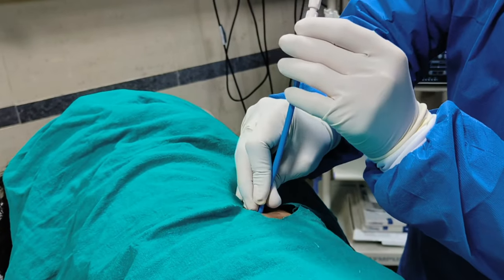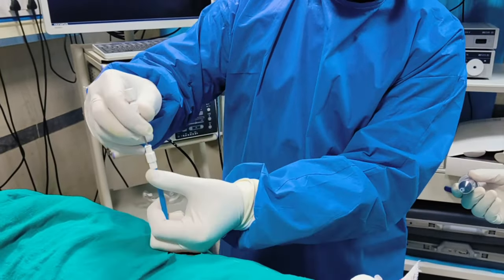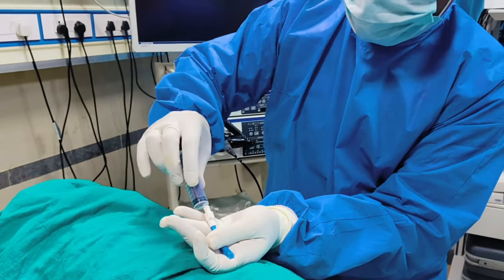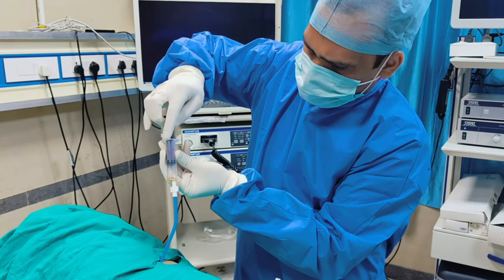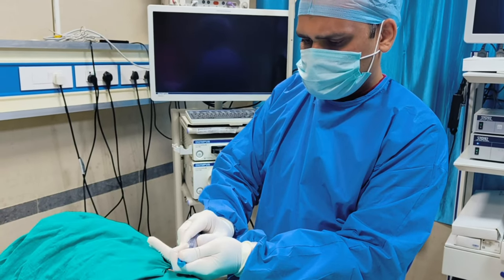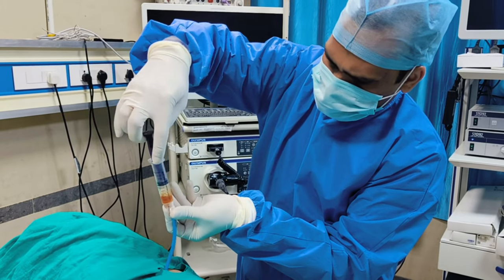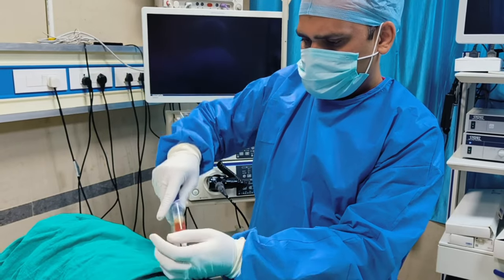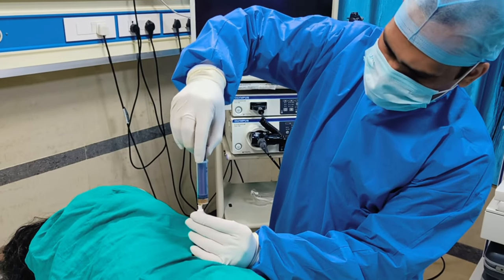The tip would have gone inside. We will insert a little more and remove the trocar inch by inch. We will take a syringe and see whether fluid is coming freely or not. There is fluid with air, which means the tip is not fully inside, so we will insert the pigtail further. Air is present, meaning the hole in the pigtail is just outside. We insert it further inside — now free fluid is coming, which means the coiling of the pigtail is inside the fluid cavity.